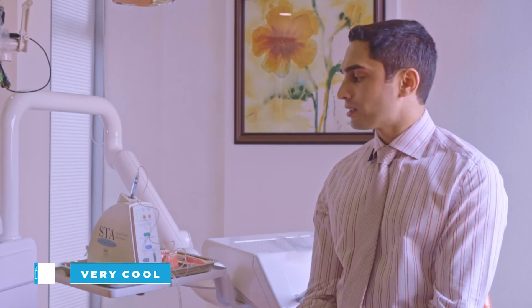In conclusion, the STA system is really effective and very helpful in my practice. On a scale of zero to ten I would rate this as a very cool. Signing off, this is your Dental Review Guy, Dr. Varun Acharya.